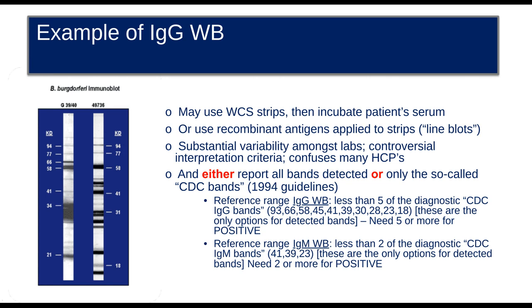Now, these two Western blots look different, don't they? The one on the left and the one on the right. I put these up to make a point. This is, of course, the same patient's serum. This is a single blood draw done two different ways by a Western blot. And the reason I put this up is to make a point that Western blots are very slippery tests to do. They're difficult to standardize from one lab to the next, from one strain of B. burgdorferi to the next. They can look very different.